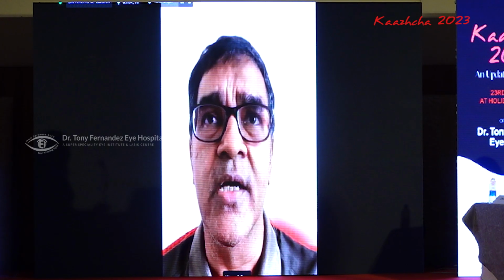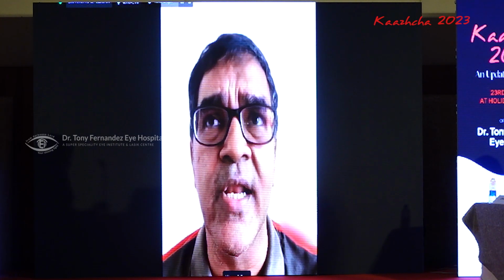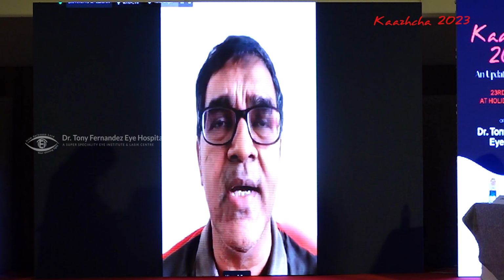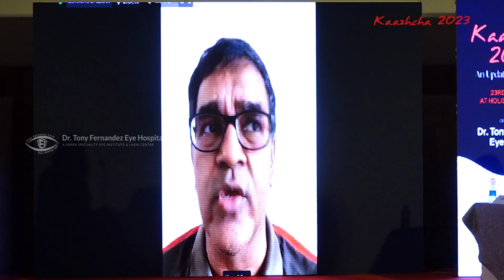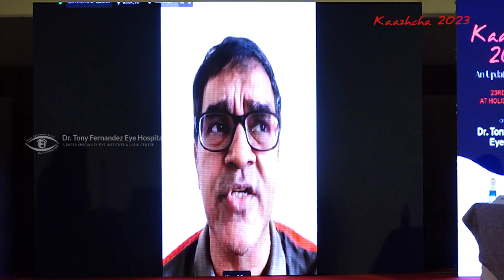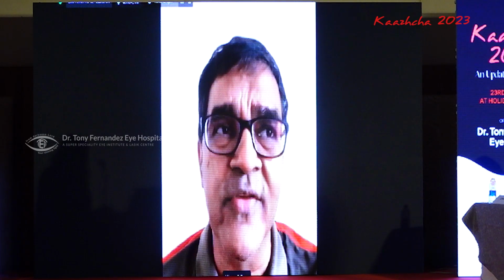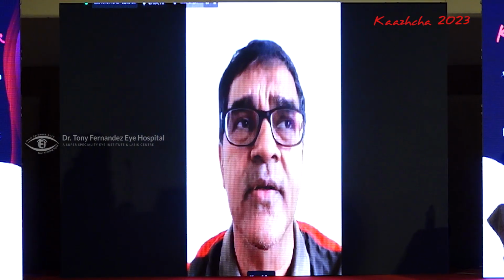But for the early screening, the early RNFL defects, many of the early glaucomas are being missed. So for established glaucoma, I think it's okay. For neuro-ophthalmology, it's okay. Bedside tests are okay. But for routine glaucoma clinic, a full established glaucoma clinic, I think that's not the way to go. For peripheral centers, second clinics, screening by the bedside, all this it's fine.